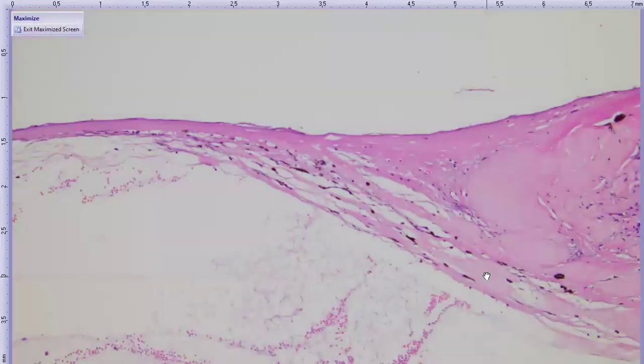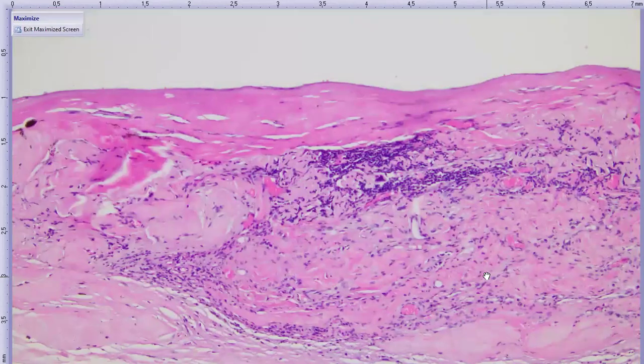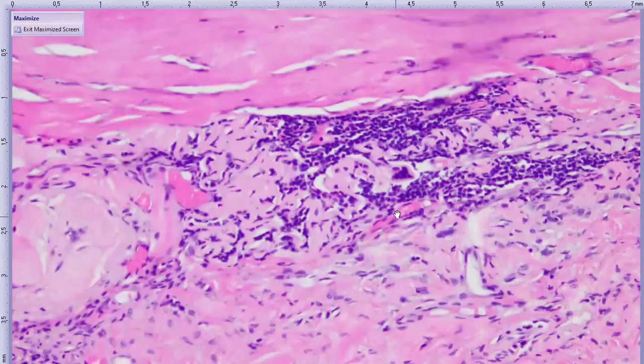And as we follow it back here, there's our collagenous plaque that we were seeing. So this is really sort of on the outside of the lens as opposed to inside it. It is dense collagen, and there are quite a few blood vessels around. This could be part of some sort of persistent fetal vasculature. I might suggest this is more consistent with persistent tunica vasculosa lentis, but it could also be just simply PHPV. I'm going to stop saying all of those words.